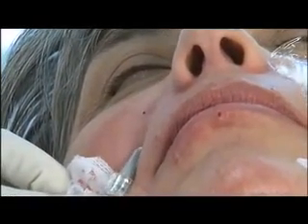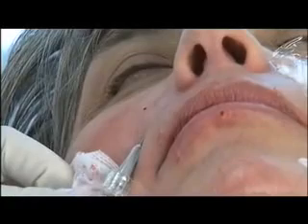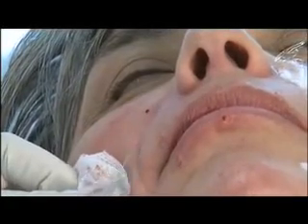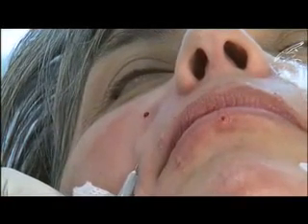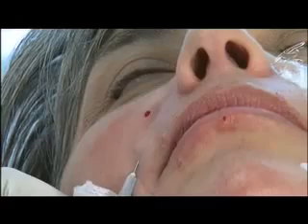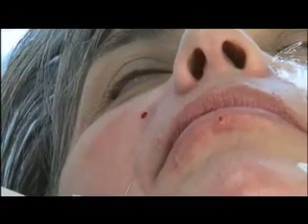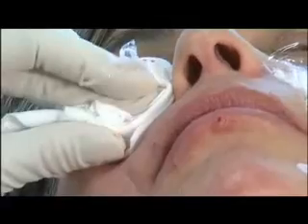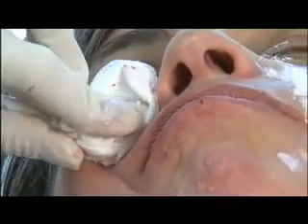Hyaluronic acid injections are usually performed through backtracking, which means that a needle is inserted into the medium dermis and the product is injected as the needle is slowly removed.